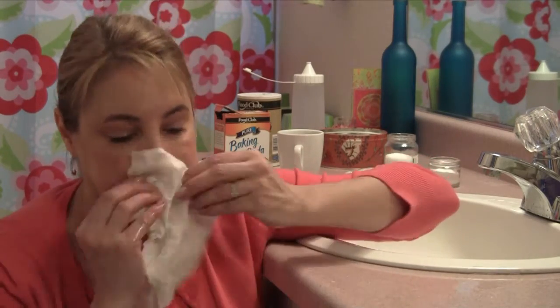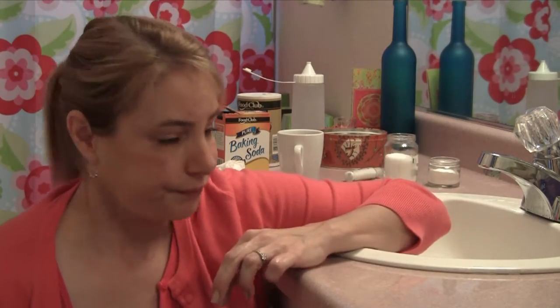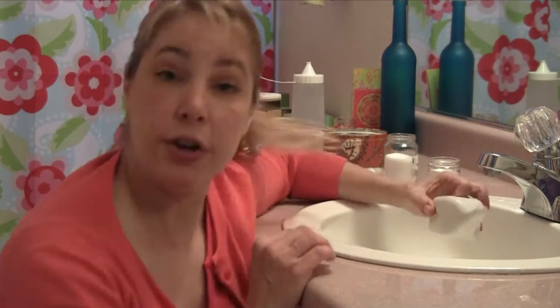So again, I'm just gonna hang, I'm gonna let this stuff in my nose soften. The water is helping it to detach from the walls of the sinuses so that it can be blown out. That's the whole point. Let me just tell you, if you think it's gross to do a neti pot, it's way grosser not to do one. All this stuff that's up in there, if it's got bacteria and stuff, which likely happens a couple times a year, at least for most of us, that stuff needs to get out of there.